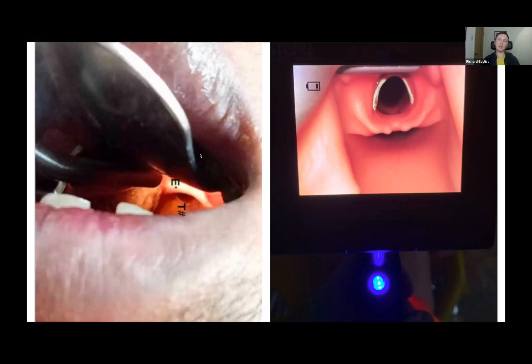And you're going to get a bougie in that hole, and then you're going to get a tube that goes through as well. And as you advance that tube, you're inevitably going to lose sight of the trachea itself as you intubate the patient. Whereas in comparison, when we've got a videolaryngoscope, so that's what you can see on the right-hand side, it's the C-MAC type of videolaryngoscope. You can see that we've got an excellent view of the glottis.